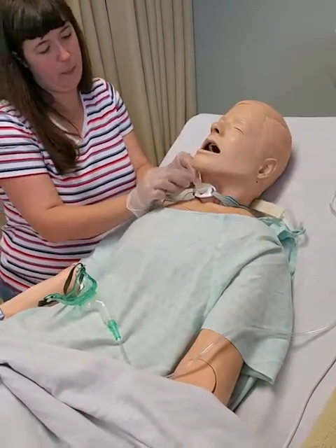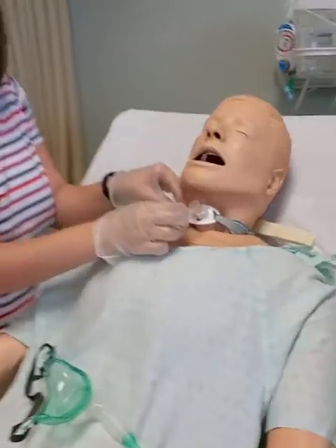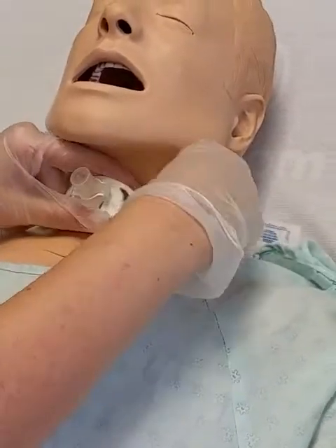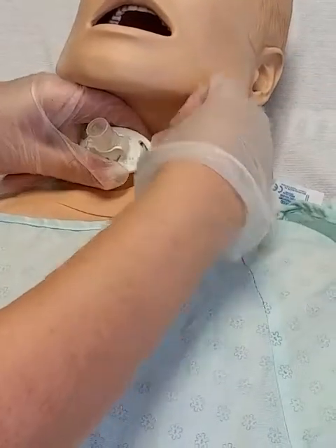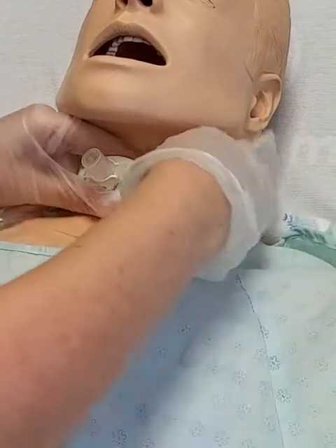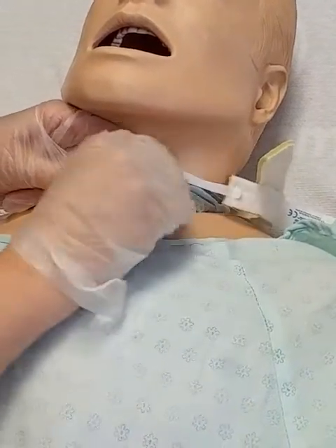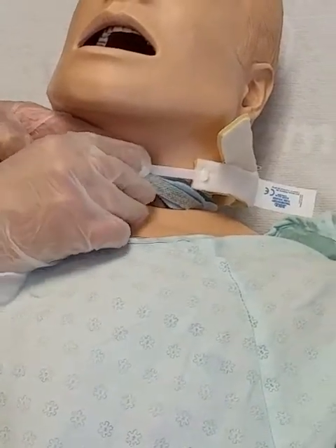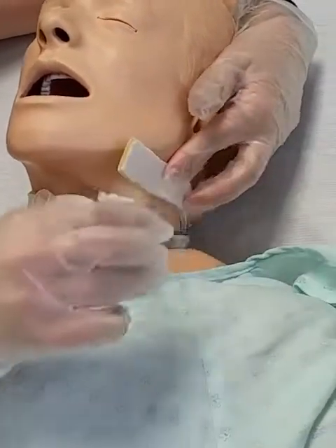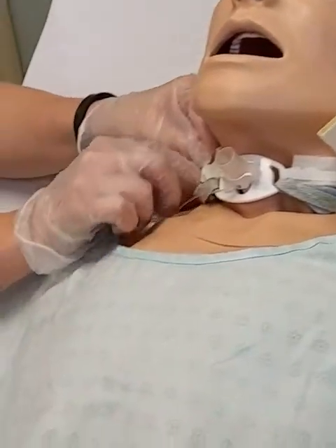Okay. And it's just a little piece of Velcro. So I'm going to attach that side. And I'm going to attach this side. Now people will be like, can I take my gloves off for this? No. You didn't want to do that. Now once you get it there, the adjustment is back here further. So I'm going to tighten it up. The new ones are on, so I'm going to take the old one off.